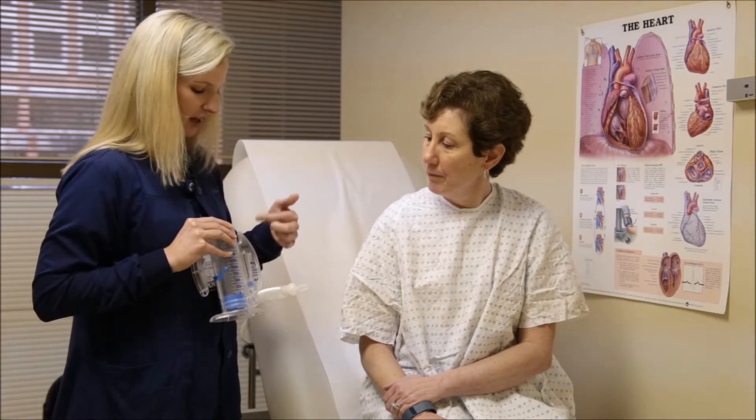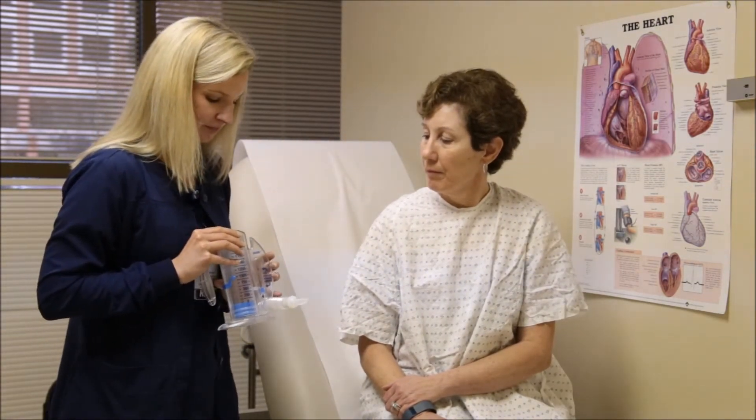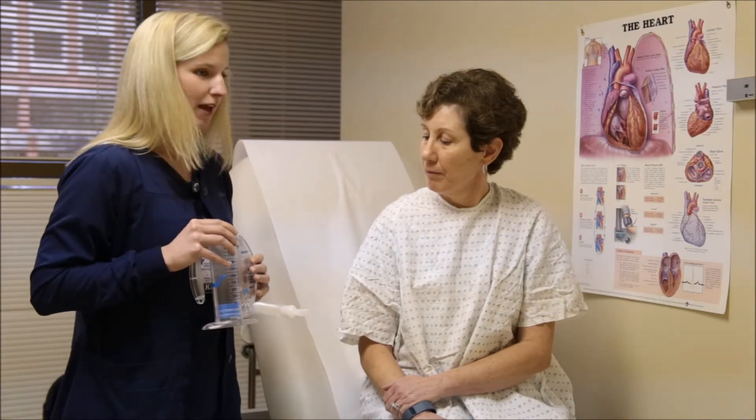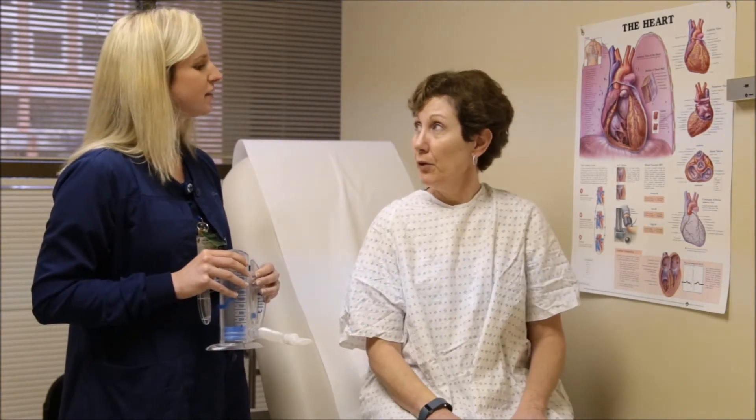If you go too fast it might fly up above the top and we don't want that — we want it to be nice and slow. So what I'll have you do is take a natural sigh and exhale and kind of feel like your lungs are empty. Can I do that? Mm-hmm.